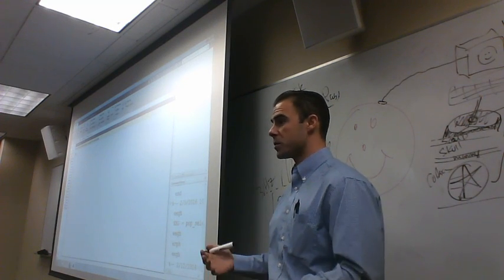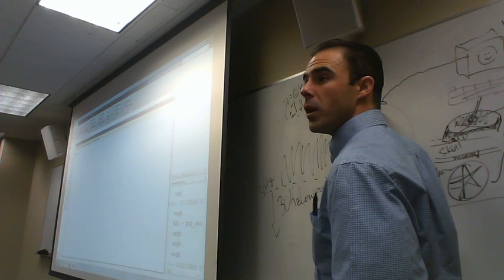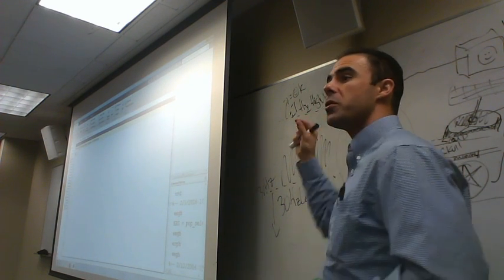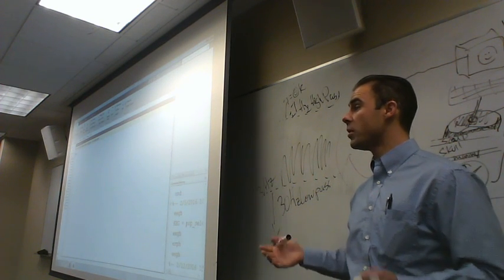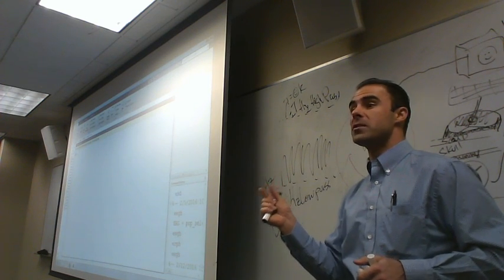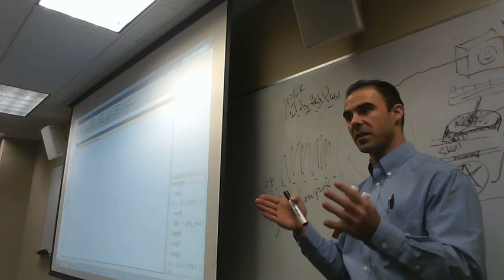Our overall goal is to understand the physiology of the mind, and what we want is to have the best understanding. We want the purest type of data. Now that does mean clearing out some of our artifacts. It helps to clean the data so we have a purer signal. But we also want the data to be the least adulterated. We want it to be the closest to the real brain activity as possible.